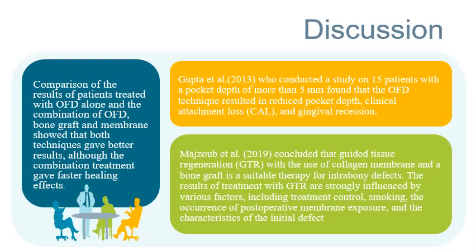Discussion: comparison of the results of patients treated with OFD alone and the combination of OFD, bone graft, and membrane shows that both techniques gave better results, although the combination treatment of OFD, bone graft, and membrane gave a faster healing effect. It is equal with Gupta et al. 2013, who conducted a study on 15 patients with a pocket depth of more than 5 mm and found that the OFD technique resulted in reduced pocket depth, clinical attachment loss, and gingival recession.